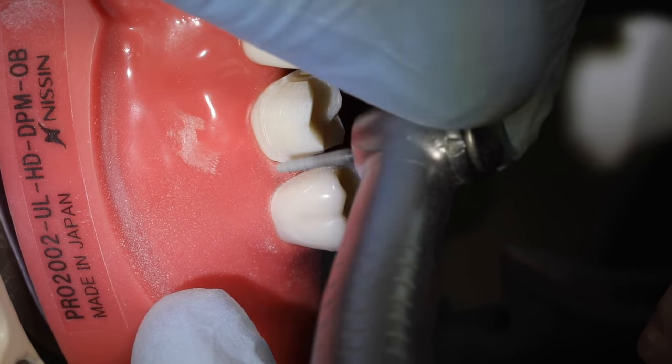When that's done, we do have to finish it off with a slight bevel, and we'll do that now. Basically, we'll round all of the sharp line and point angles, just a very slight rounding. We'll do the same with the marginal ridge areas.